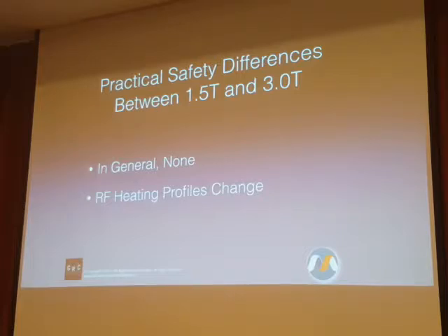So the other thing I don't want you to take away from this is the idea that everything at 25 to 30 centimeters is dangerous at 1.5. If it's MR conditional, the manufacturer is standing behind their assertion that it is safe as long as you follow the conditions of this.